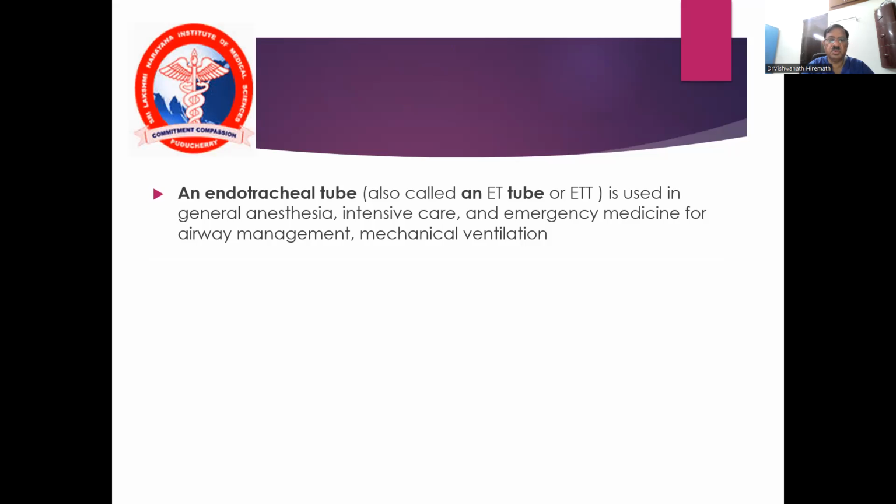Endotracheal tube is also used in general anesthesia, intensive care, respiratory support where the patient requires invasive mechanical ventilation, and emergency medicine for airway management, for trauma, asphyxia, pneumonia, community acquired pneumonia.